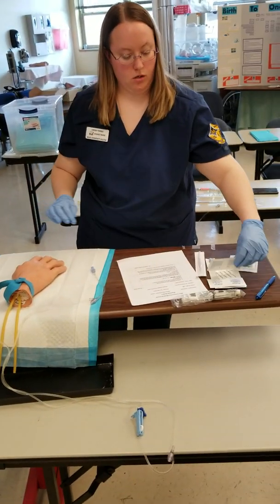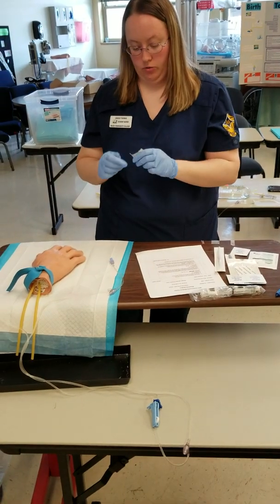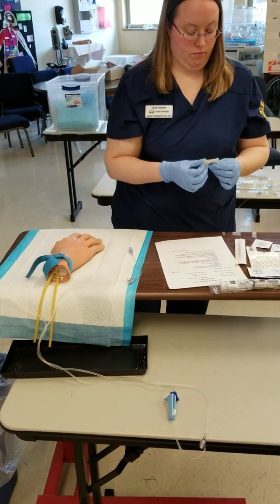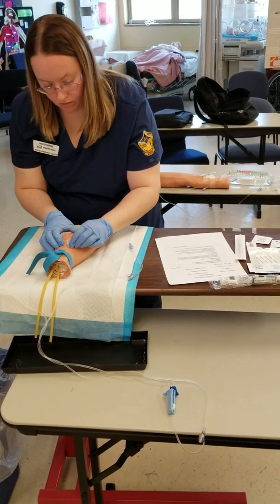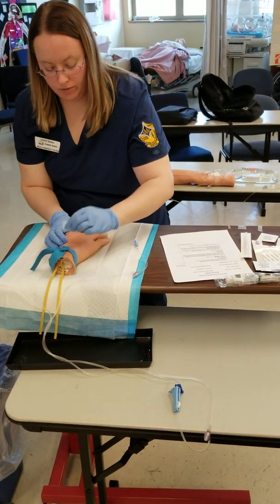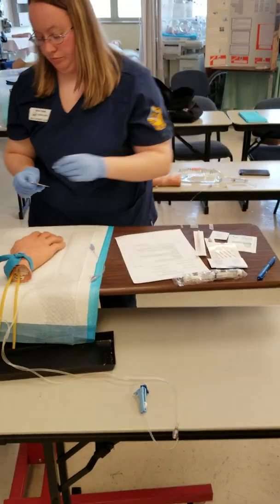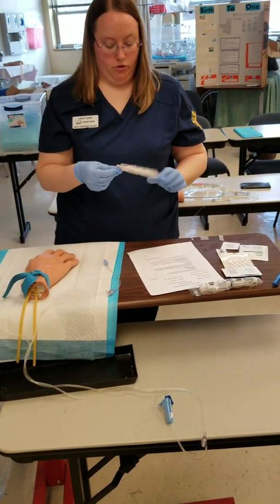And then I will use an alcohol swab to swab the area. Going to swab in a circle and then go up the vein. And then I'll give that enough time to dry.